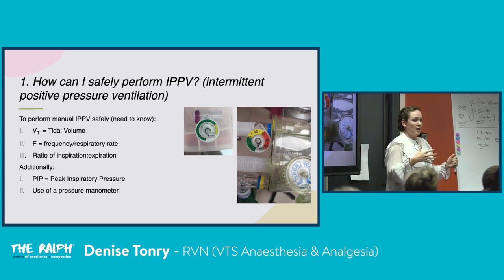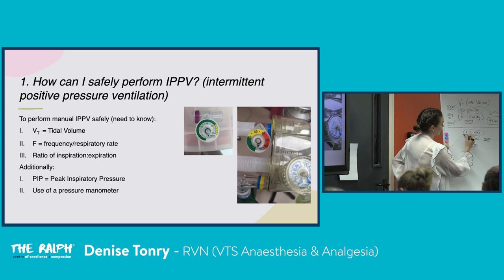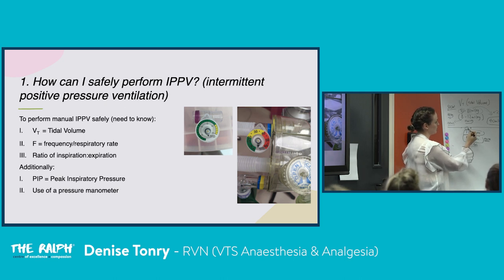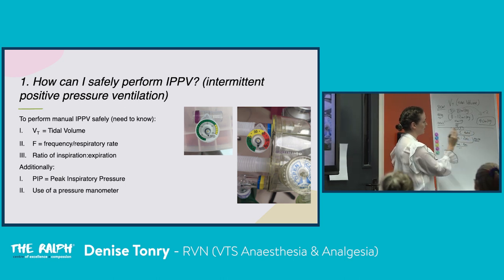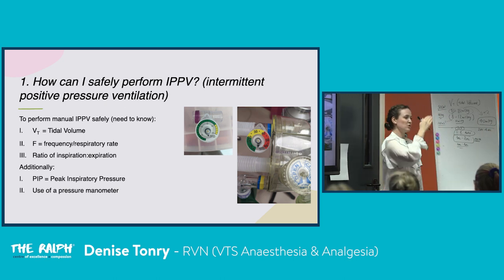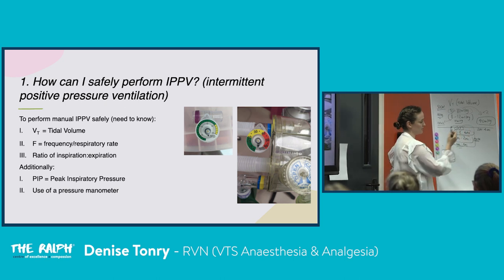But again, what we're trying to apply is the knowledge and then to look after them to the best of our ability. I used to be confused by this. So an inspiratory time of 1 second, expiratory time of 2 seconds. This is an inspiratory to expiratory ratio of 1:2. So this is an easy calculation, 1 second and then twice for the exhalation. If you inhale for 2 seconds, so you hold the bag, inhale over 2 seconds, you should allow to exhale for 4 seconds. So the ratio changes like this. You can manipulate the ratio, but generally this will do most IPPV.